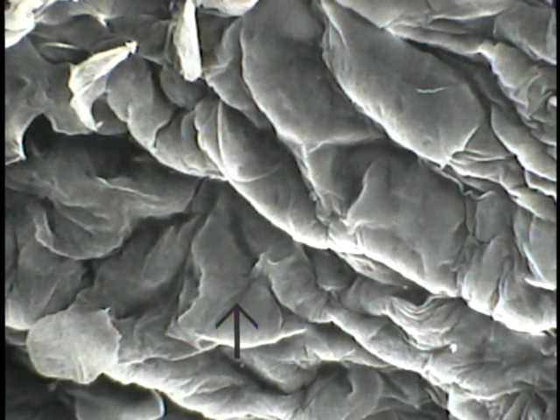This particular figure is the surface, as seen with the scanning electron microscope, of the esophagus. So we're looking at the luminal surface with the scanning electron microscope. What this shows is exfoliating squames, intact cells coming off from the surface. Here would be one of these flattened squame-like cells. Another one here. This one is becoming dislodged, as is this one, and finally exfoliating into the esophageal lumen. So this is a surface view of the stratified squamous non-keratinized variety of epithelium lining the esophagus.